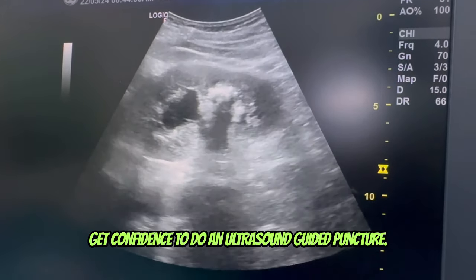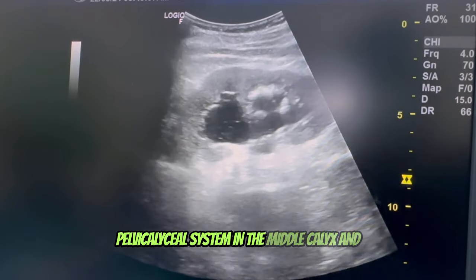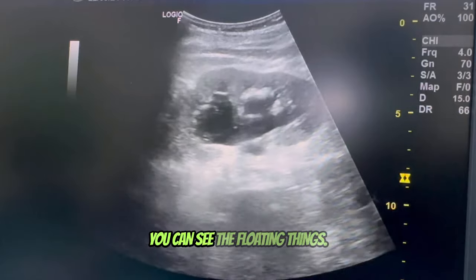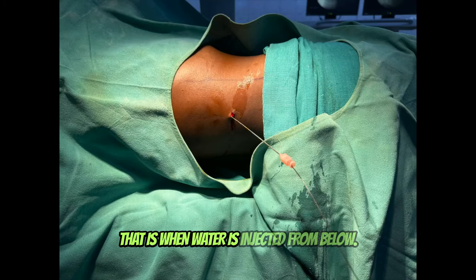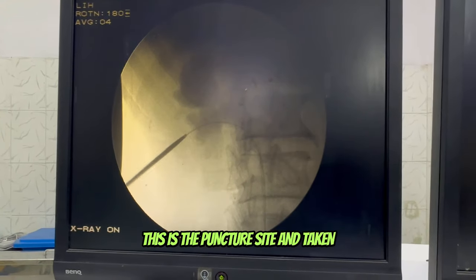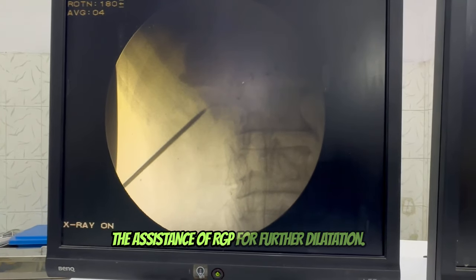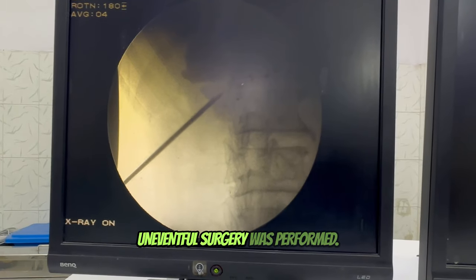You can see the needle beautifully inside the pelvicalyceal system in the middle calix, and you can see the floating things — that is when water is injected from below. This is the puncture site. Taking the assistance of RGP for further dilatation, an uneventful surgery was performed. Thank you.